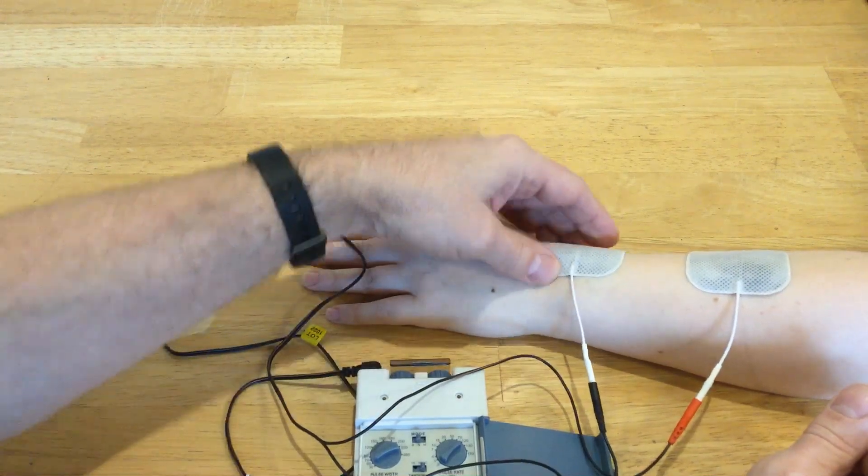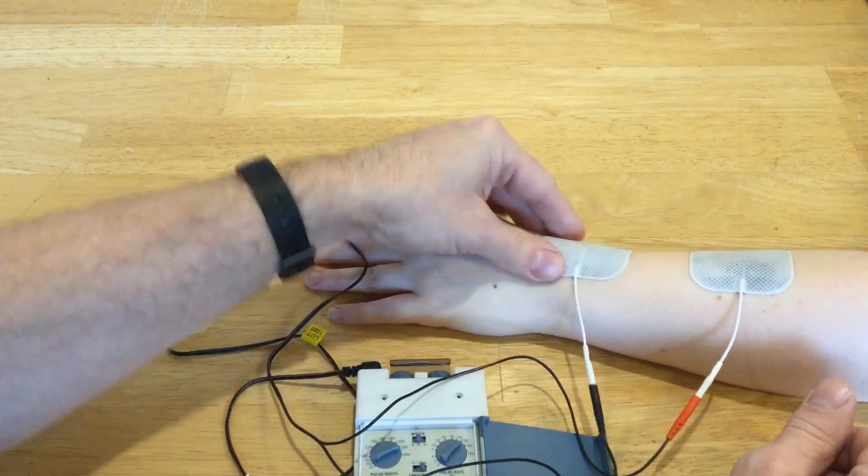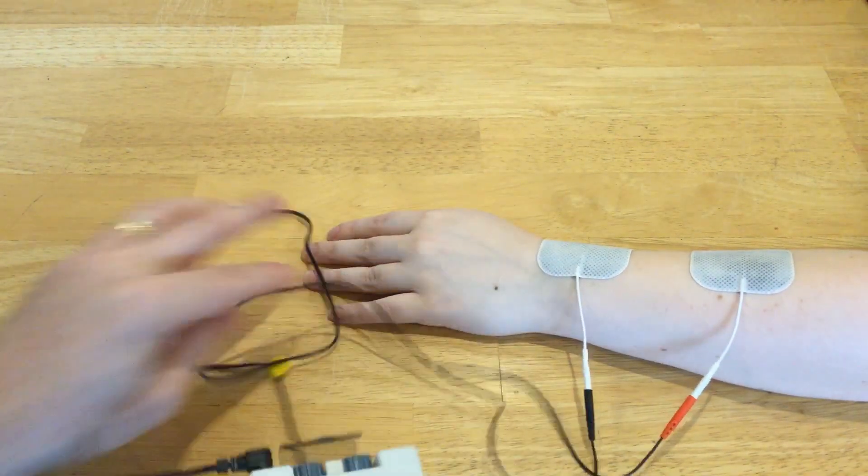As far as your electrodes, you generally just want them to be at least an inch apart and well adhered.